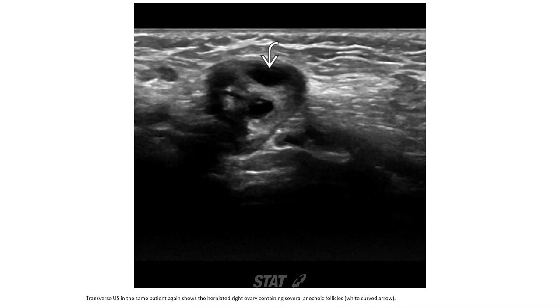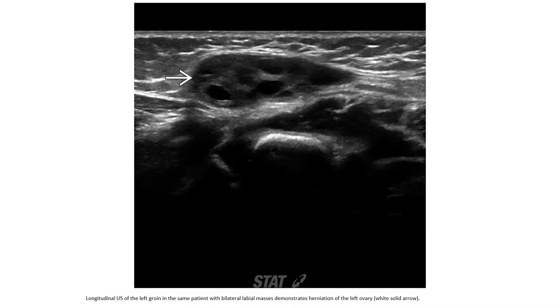Ultrasound in the same patient again demonstrates the herniated ovary containing several anechoic follicles. Ultrasound of the labia in the same patient with bilateral labial mass demonstrates the herniated ovary.